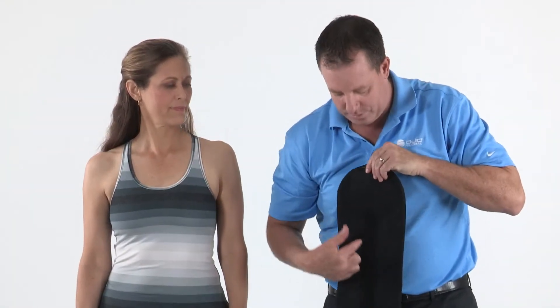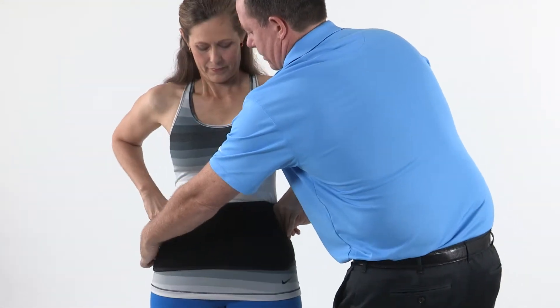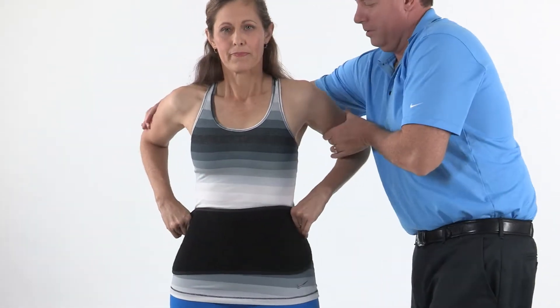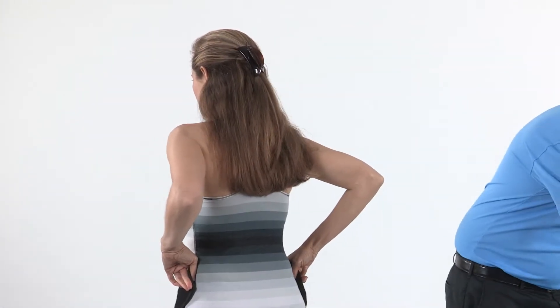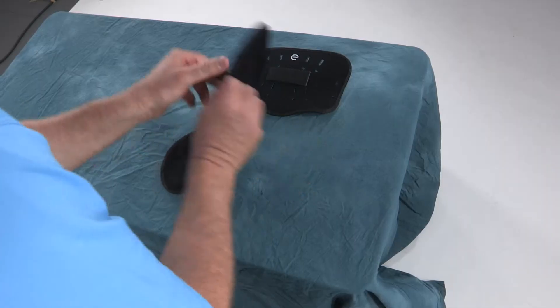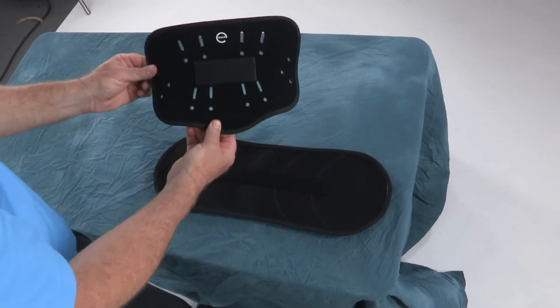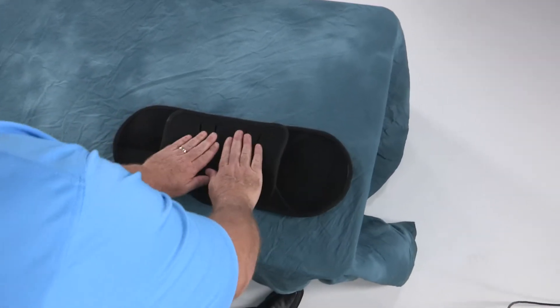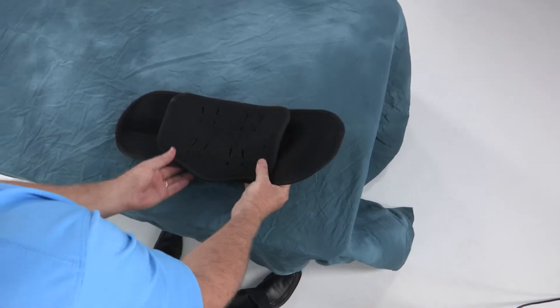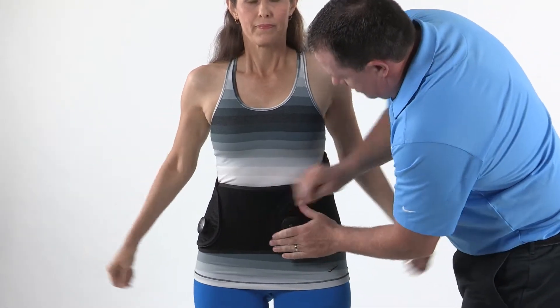If your patient is slender, it is optional to fit the brace using only the anterior belt wing. To do so, lay the anterior belt wing on the front of the patient and have the patient hold the wing in place. If you are using the anterior panel, attach it to the center of the anterior belt wing. Next, position the posterior section evenly in the back and wrap either end of the posterior section around the patient's hips to secure.